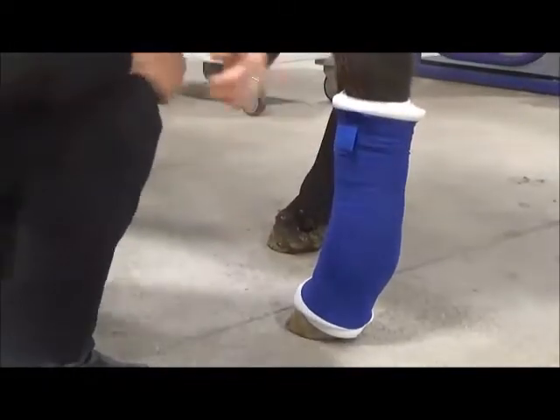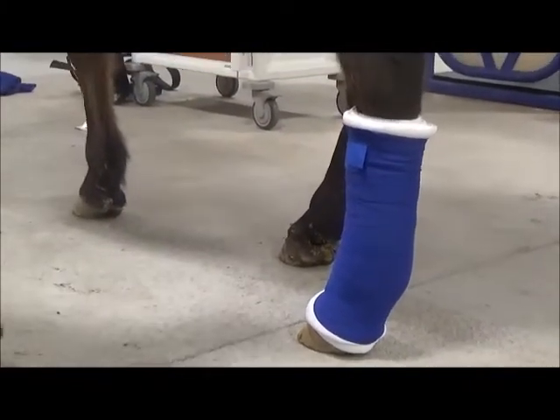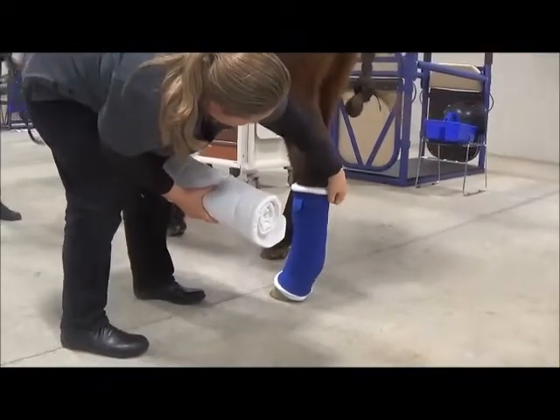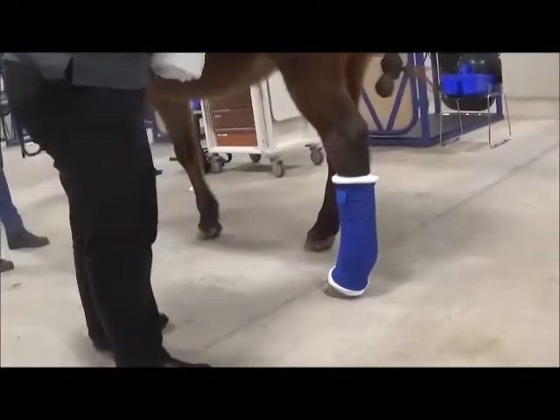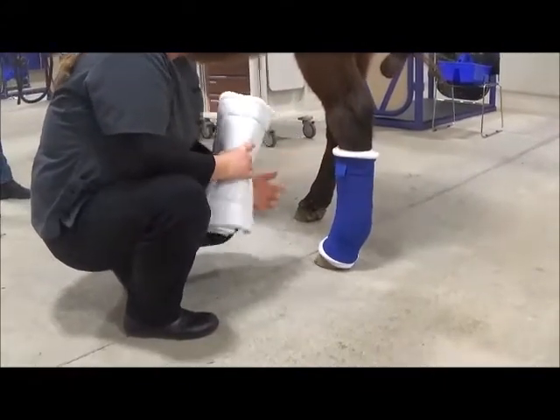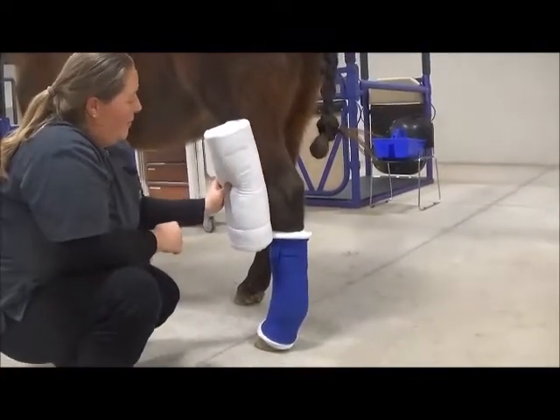So then the next layer, I'm just going to put right on top of that. And it's important, you don't want to overlap these 2 bandages. Some resources will tell you to do that, but when you do that, especially if you're bandaging a horse for long term, they tend to get pressure sores where the bandages overlap. So it's important that they actually just stack right on top of each other.